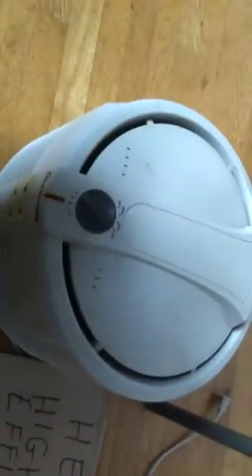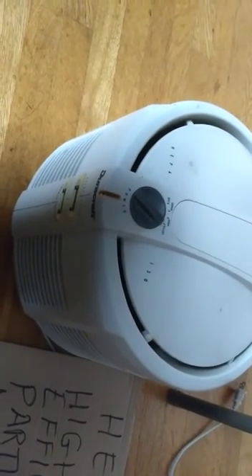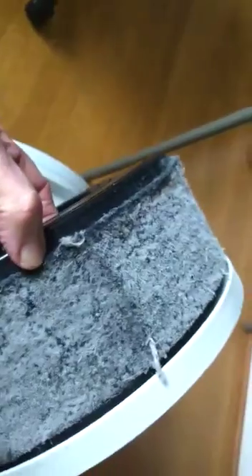Now what I have here is a picture, what I have here is a HEPA filter, which is a commercial HEPA filter, a room filter. And let's look at what's inside this. You'll find that it's very similar to the HEPA filter that is the initial part of an oxygen concentrator. Now this one is quite filthy. It has not been cleaned for a long time.